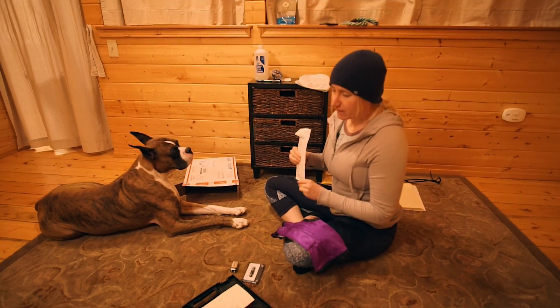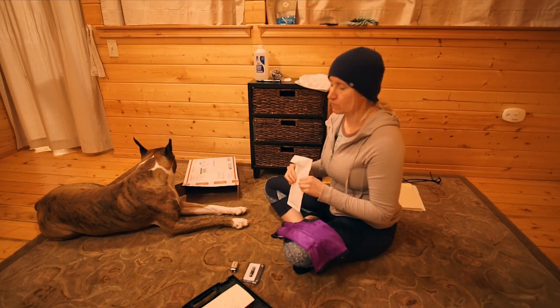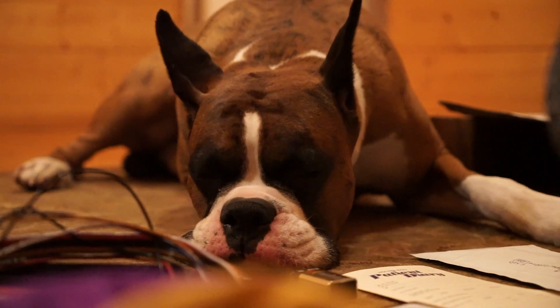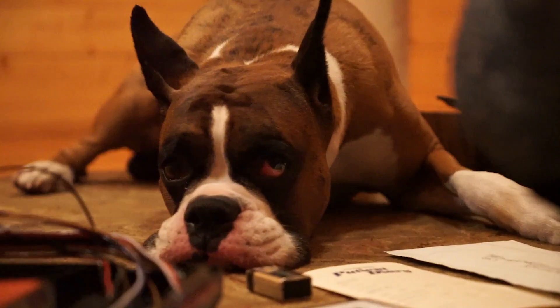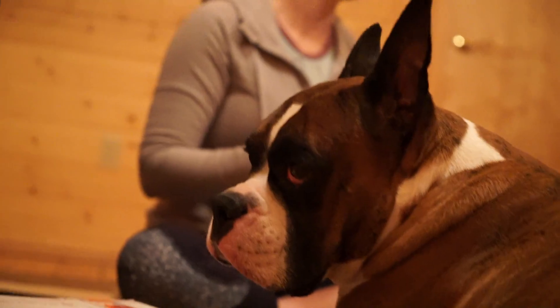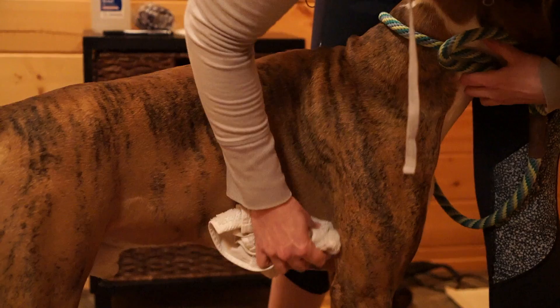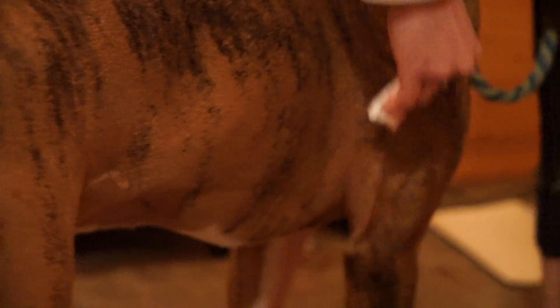They recommend shaving him, but he has a super, super short, tight coat and we don't really think it's necessary. I discussed it with Amber and she said we didn't need to shave him. So instead of shaving him, we're just going to clean up his coat really well and rub him down with a little rubbing alcohol, making sure there's not any oil or loose hair so that the contacts don't come off during his 24 hours.